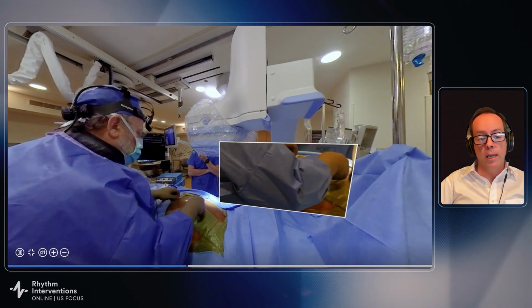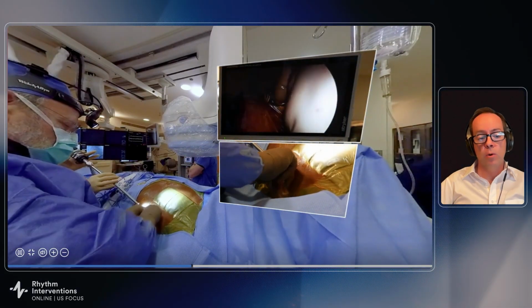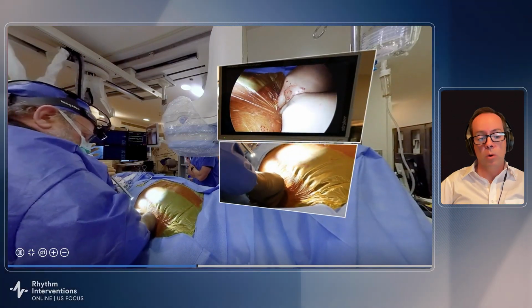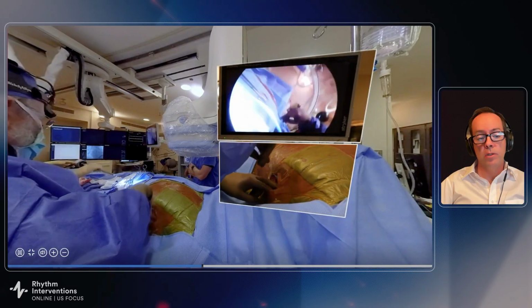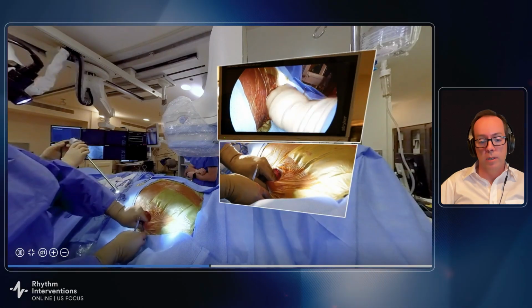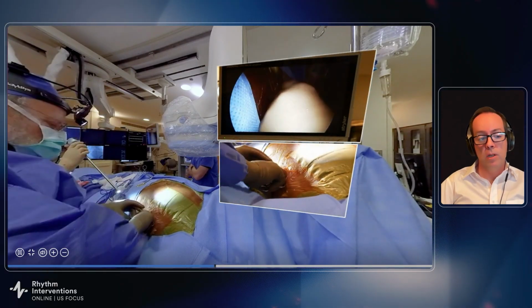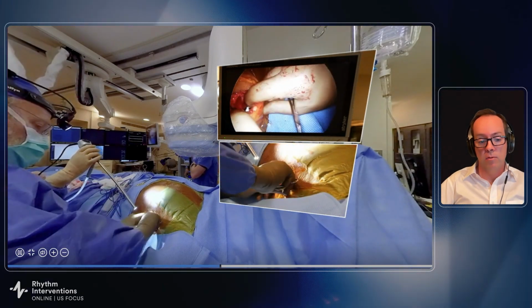I frequently am on the other side of the table working on the paraxiphoid pocket while the fellow or the APP is working on the lateral pocket. This is for pocket creation. This can also help in tunneling, but also for closure, so that two people are closing at once, keeping this down to possibly 30 minutes with about 5 to 10 minutes of good prep time.